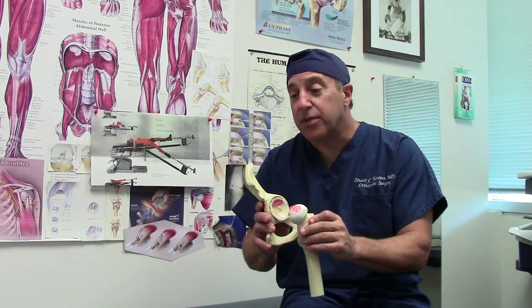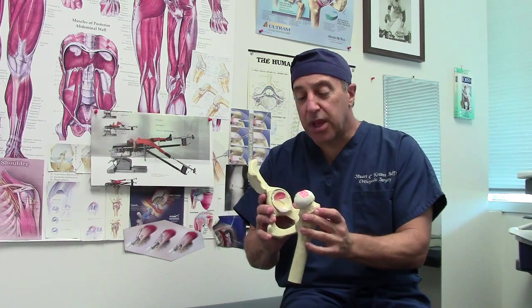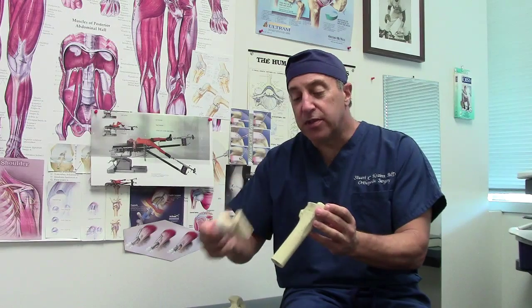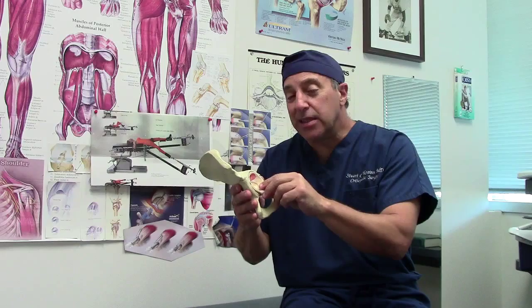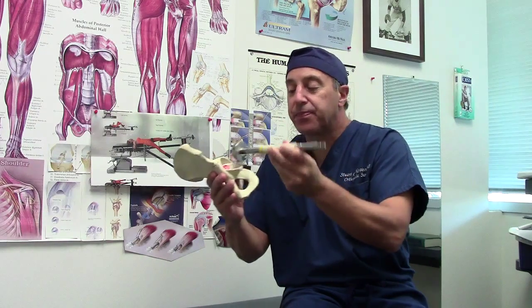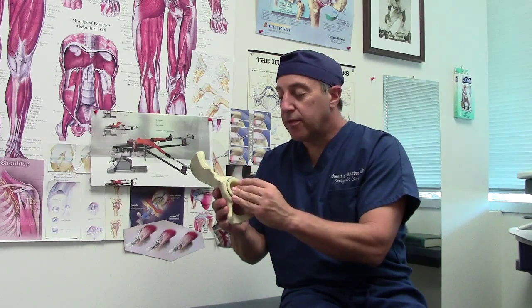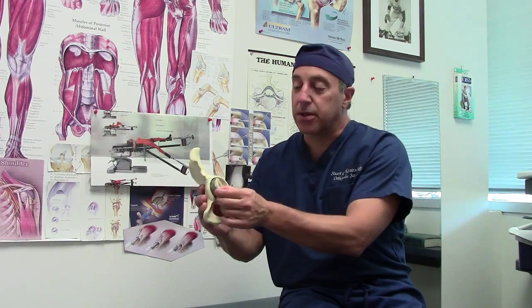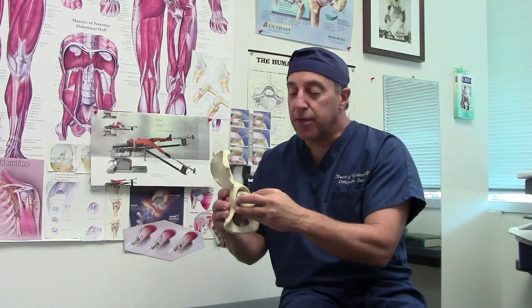I have to say I'm even more impressed with it now after having done 800 than I was early on. With the table allowing the hip to be dislocated, a saw takes the femoral head off and moves the femur out of the way. That allows us to work on the socket side. An x-ray machine allows me to look inside the pelvis. The socket is treated with a reamer that takes away the old cartilage, and it leaves a space that's perfectly proportioned for the socket component. That's checked on x-ray to be in the right position — that's one of the big advantages of the anterior hip, as the x-ray allows you to confirm the position of the cup.